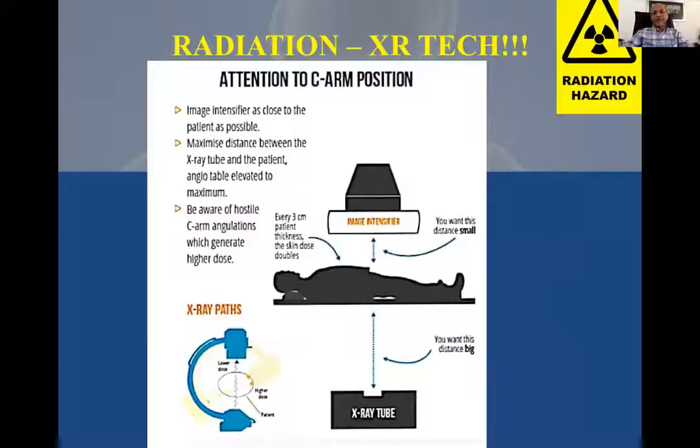So you want this distance to be much bigger than the distance on the top. So the X-ray tube should be as far down as possible, and try to keep it down. And if you have to stand, try to stand at least 3 feet away from the X-ray tube.